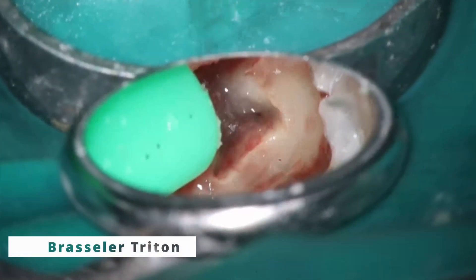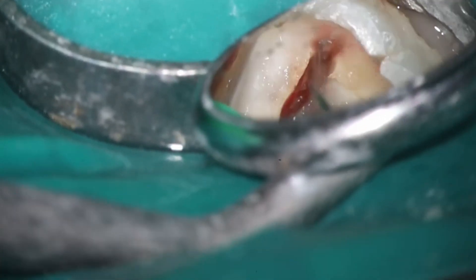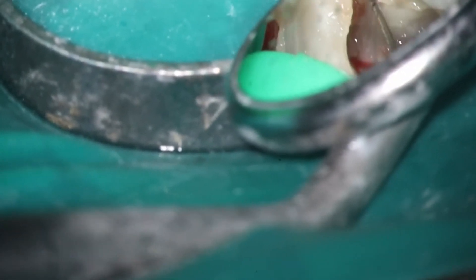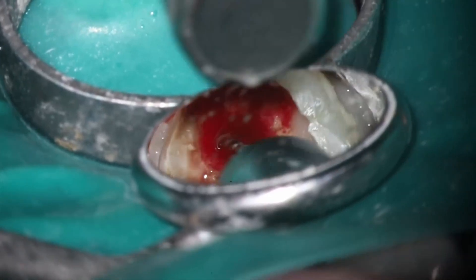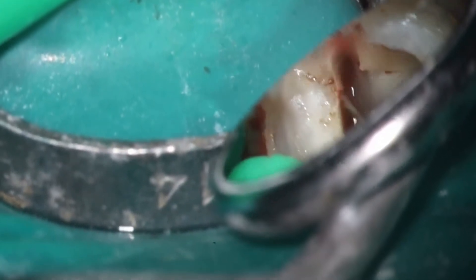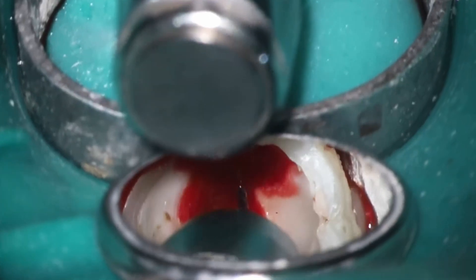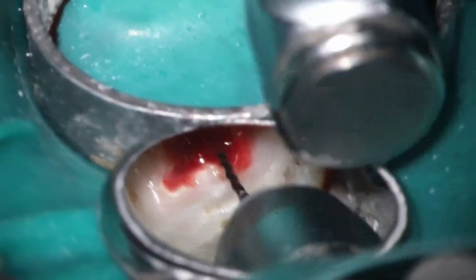I'll drop a link to that curved canal video if you haven't seen it. When you're dealing with really tight curves and skinny canals, there are a few things to keep in mind. You'll notice that's why I started with a size 6. I haven't taken that 20.06 down the ML or the distal lingual canal at this point either, because I want to see how thick it is and how bad that curve is. I'm just poking around and feeling — thankfully it dropped about halfway down right away, telling me this is not that skinny of a canal. Keep things nice and small when working on any Radix case because they are going to be curvy and skinny. The 17.04 is going to be my final file on this case.